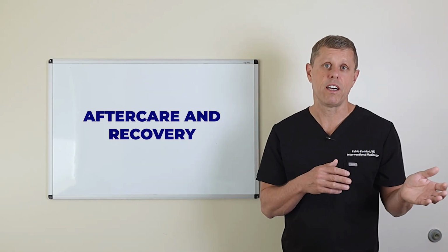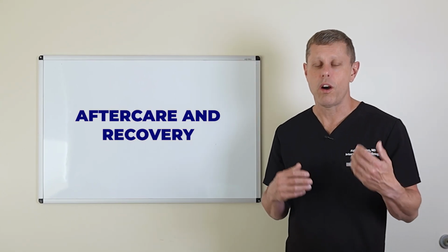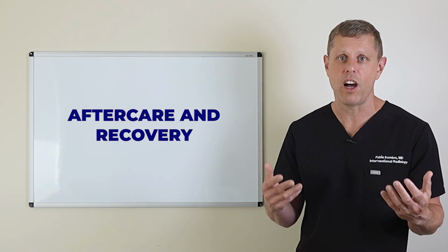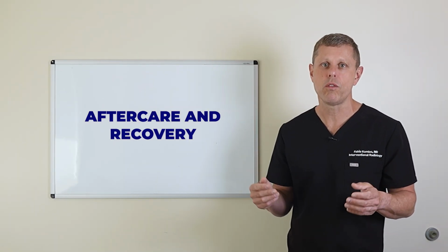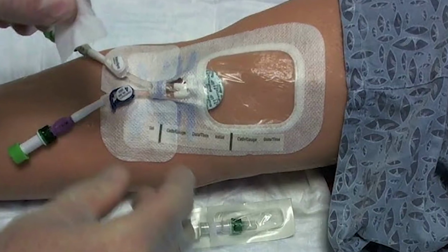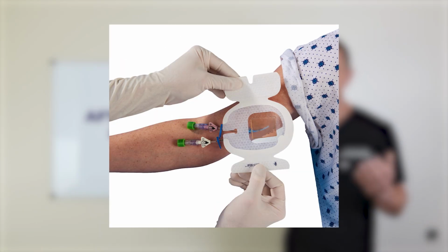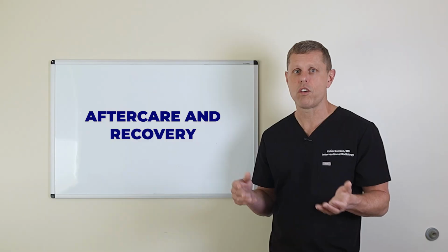They can be changed by a nurse, or people who have it long-term learn how to change the dressing. Obviously, every time you change the dressing, you have to make sure you don't pull the line, dislodge it, or do anything like that. People who have it for a long time get used to it, and people who have it for a short time usually have a nurse come in and help them change the bandage. They use special dressings that are made for PICC lines, and they're very good to secure the line and keep it clean.